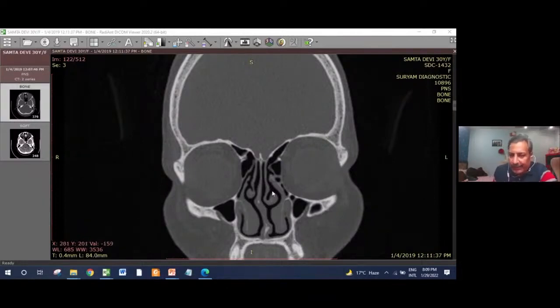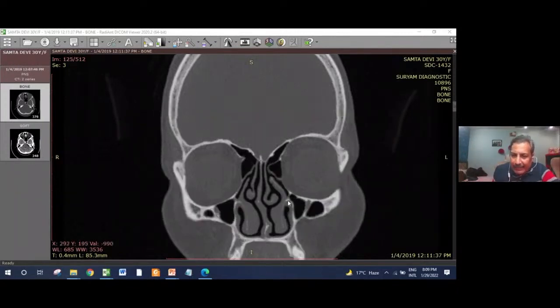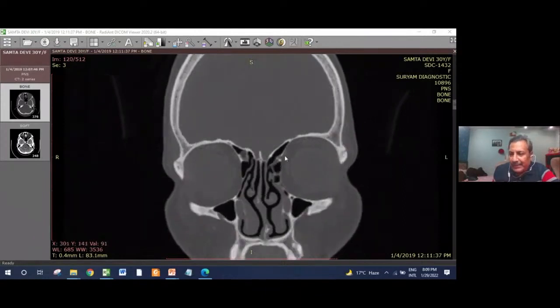You can go behind and fracture it out, all these things anteriorly, to widen the drainage pathway. And you can use any instrument and come anteriorly. Using the instrument behind in the cell and coming anteriorly is a much safer move than going behind with the tool with a jerk towards the skull base. So that is a much safer move. And with this kind of uncinate attached to the lateral wall, it is pretty safe.